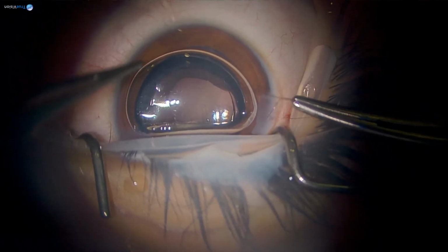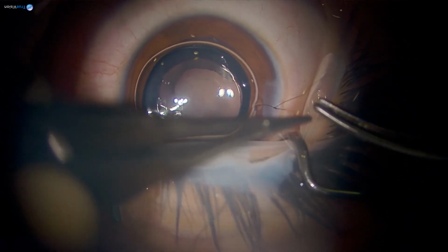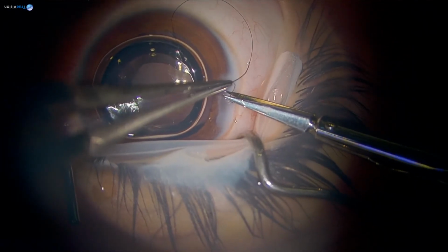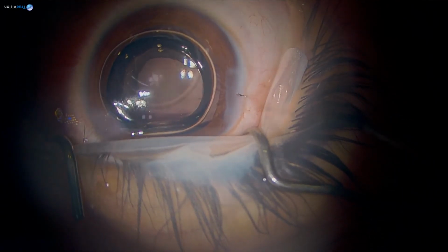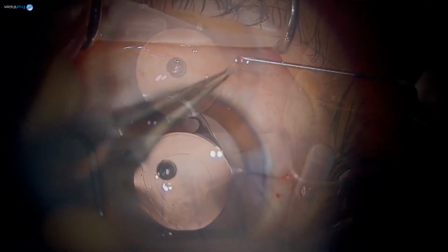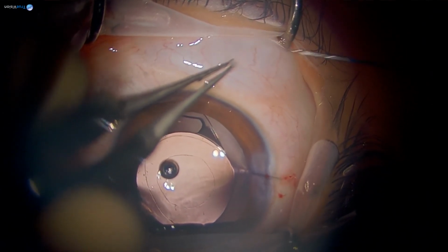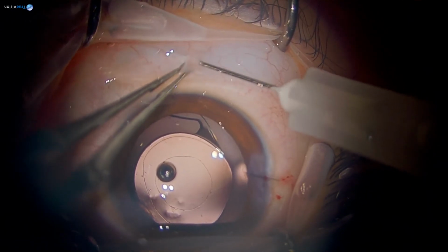But what sutures do you use in a child? Do you use absorbable? What do you prefer to use? Yeah. Again, Bangladesh is almost similar to India. In India, we use 10-0 nylon. The reason is chances of infection. When I was in the US for the fellowship, there 90% of the patients got Vicryl suture. So the preference is definitely 10-0 nylon.